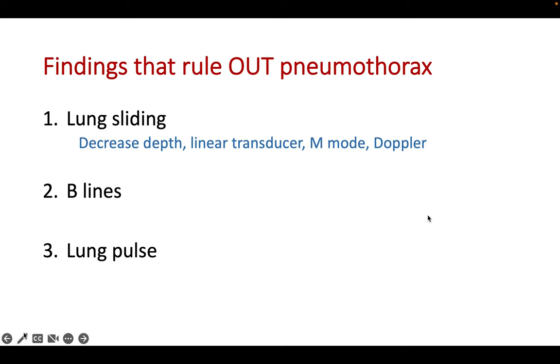In summary, there are a number of findings that will rule out pneumothorax. The most useful is lung sliding. If you have trouble visualizing lung sliding, you can decrease the depth, use a linear transducer, use M-mode, or apply Doppler.